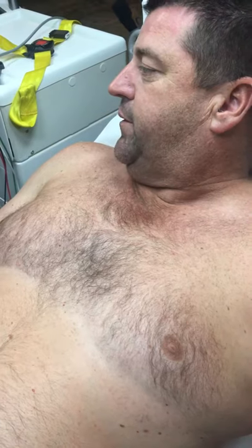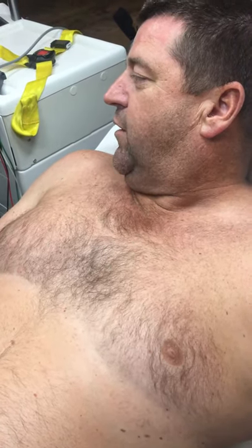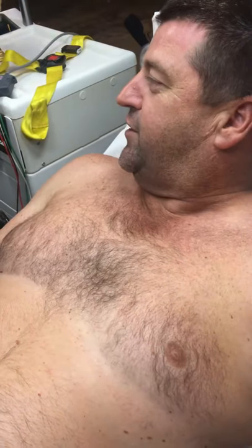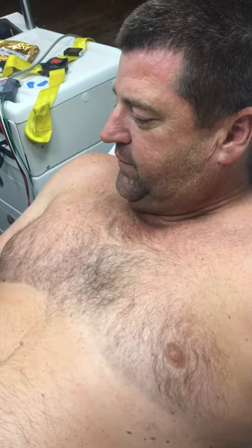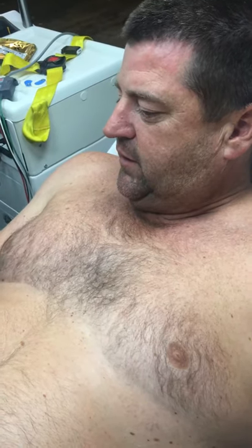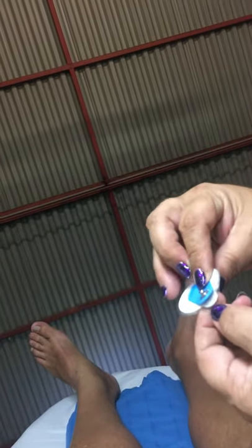We're going to do wrists and ankles. Just whip that one open — be aggressive with it. People are dying here, don't have time to look at the instructions. Just whisk the plastic coating off and rip the back off. So that's right wrist. Then both my ankles, on the inside. Does it matter which way they face? Not at all — just whack it on. I'm going to have fun removing these later.